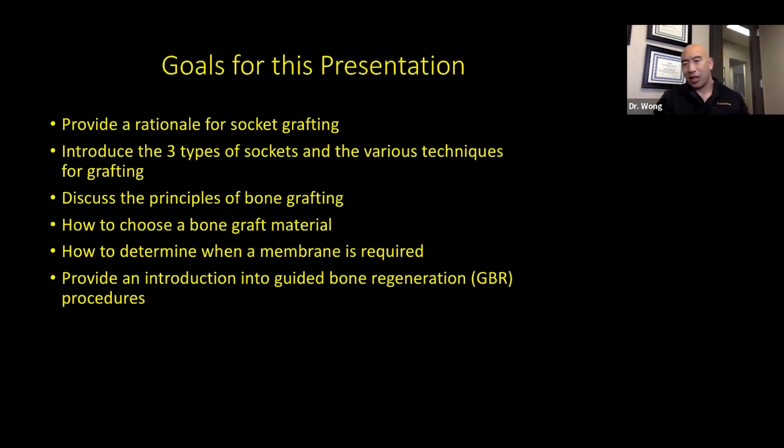That's probably the most underutilized technique or procedure that I see in implant dentistry: people take teeth out and they don't think far enough ahead to graft the socket and prepare the site for an implant. Usually they treat the toothache by taking the tooth out and just take it out. And then later on, they're thinking, oh, the patient now wants an implant. So this is just something that we need to talk about.